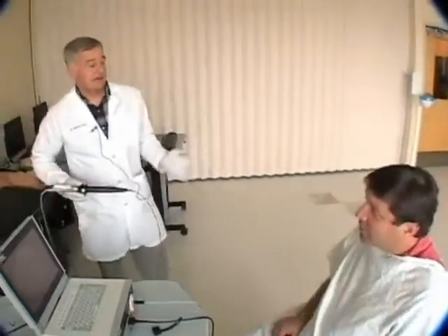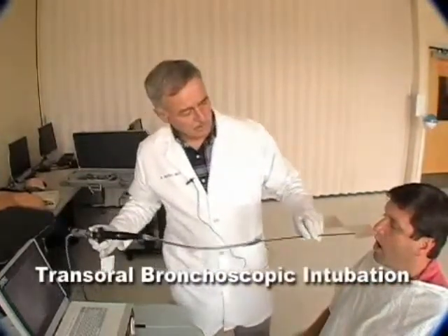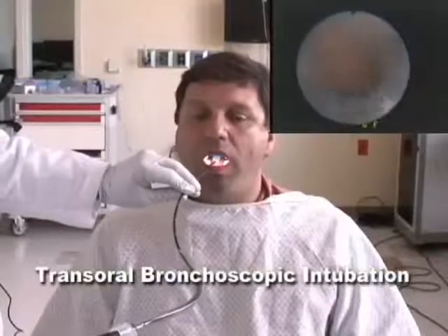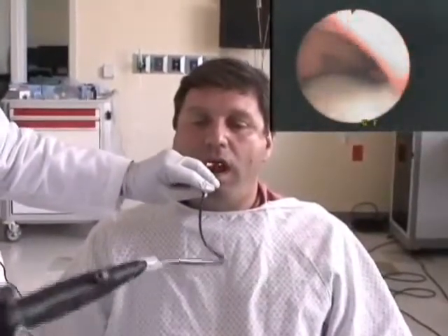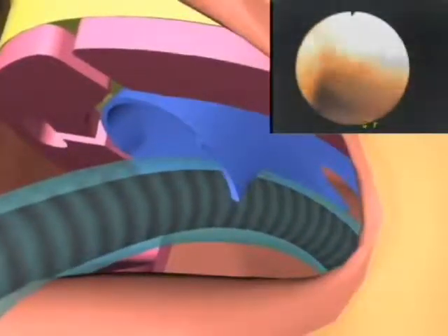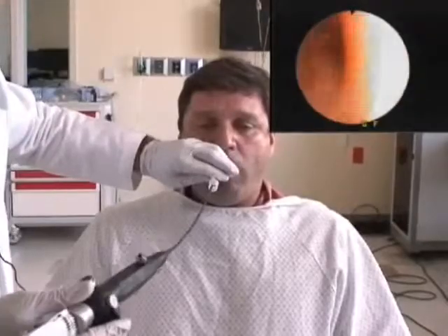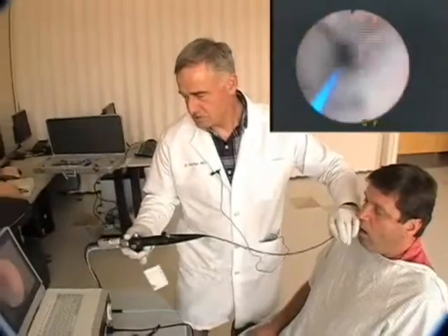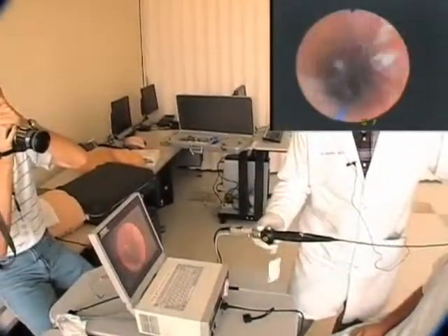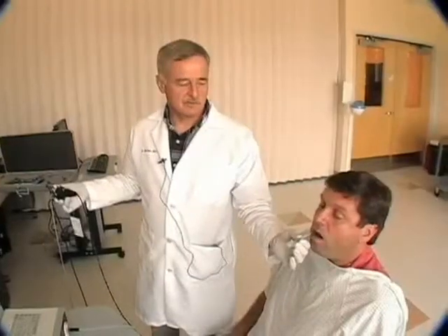I can intubate you now. Now we're going to do transoral bronchoscopic intubation. Here we go. Watch the scope as we come out — just to show you that we are intubated now. I'm sorry he's coughing a little bit, but we've now secured a transoral airway using the Rotix device.